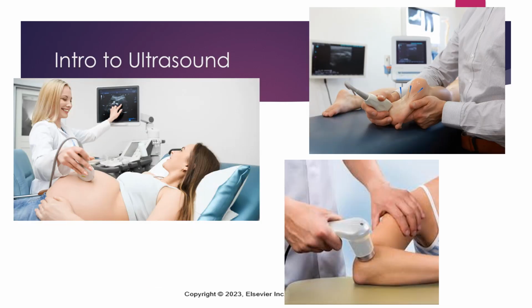So on this slide here, I have a few different images. Looking at the top left corner to start with, this is probably something that you are more familiar with, and when you hear the term ultrasound, this may be the first thing that pops into your head. We're using a different type of therapeutic ultrasound in our classes, but the one on the top left and the one on the right-hand side would be more of a diagnostic ultrasound. So those are used to help produce images, take pictures, things along those lines.